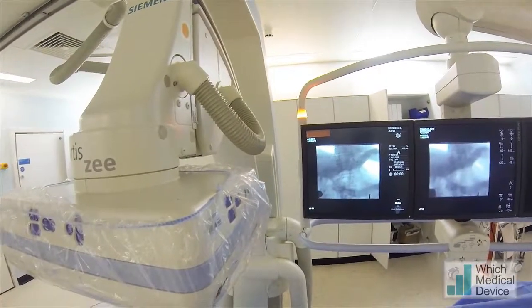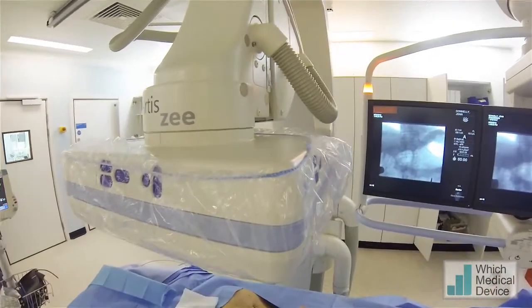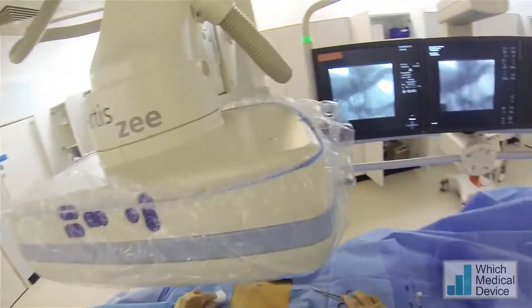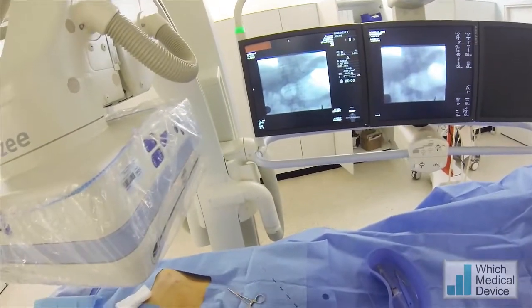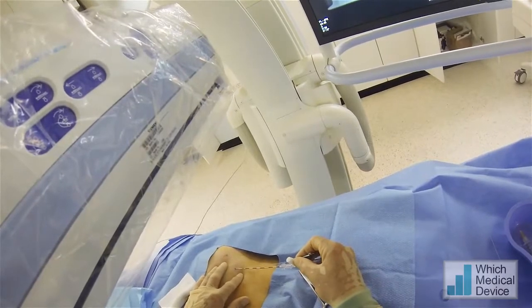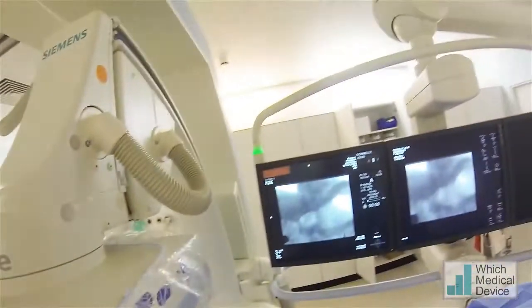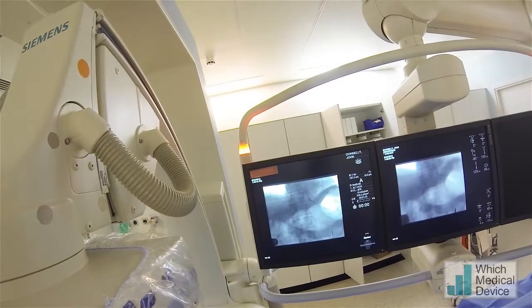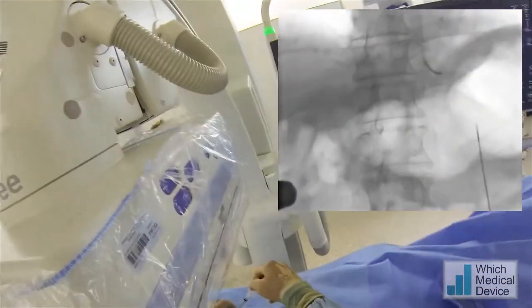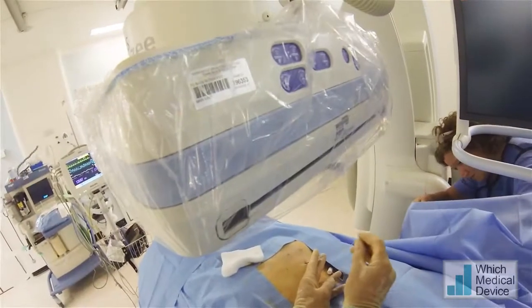You can see the position of the first Gastropexy, which angled up, will take us into the stomach. Once we pull that down, tightening the Gastropexy, it will make the others easier to insert. So it's the first Gastropexy device — a little bit of tension on the thread. Just a bit of pushing. That's into the stomach. That's going to push the T-bar free into the stomach.